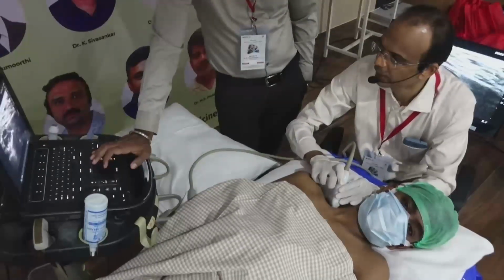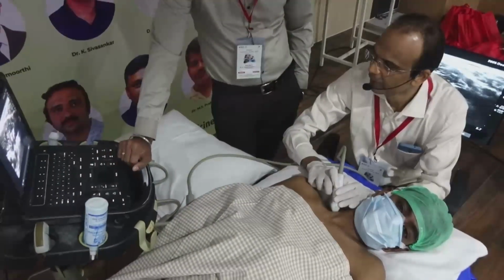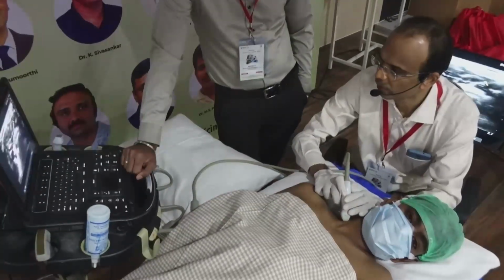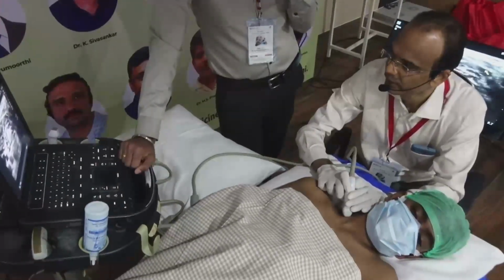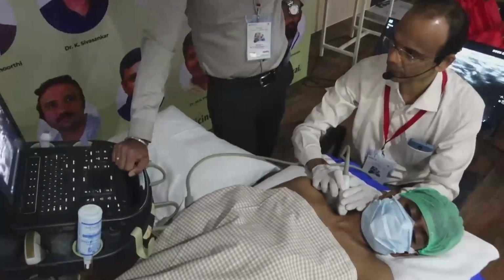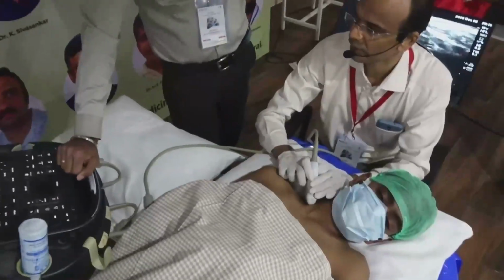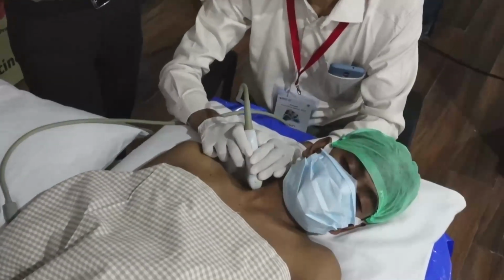Then we can understand the upper trunk in a better way. So why is identifying omohyoid important? Just below the omohyoid, that proximal-most component of the upper trunk, that is the suprascapular nerve, it comes below the omohyoid.